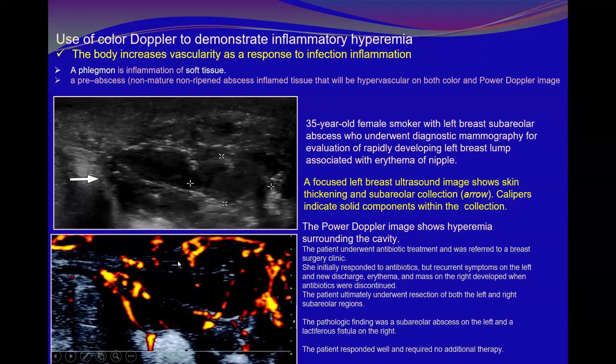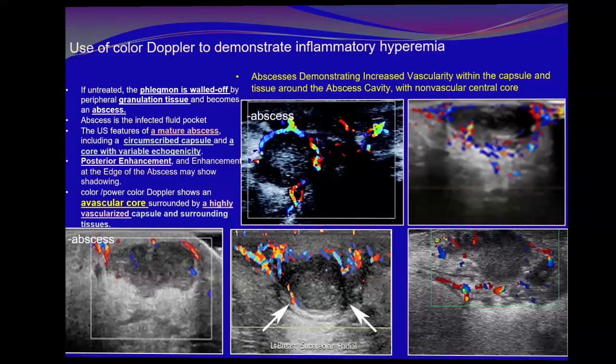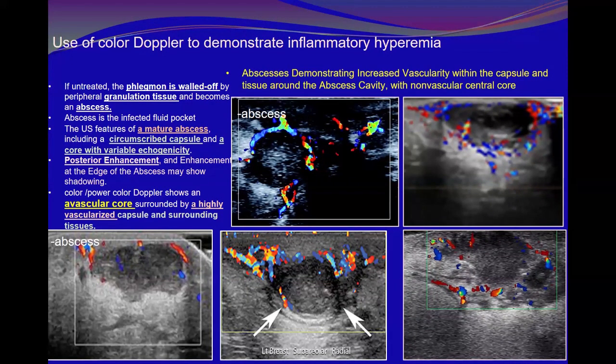This is the abscess only. This portion is an abscess, and the remaining is extensive phlegmon. Then after the patient is treated, this hyperemia will subside. So the phlegmon, okay, is tissue inflammation wherever in the body. Tissue inflammation, we call it a phlegmon.